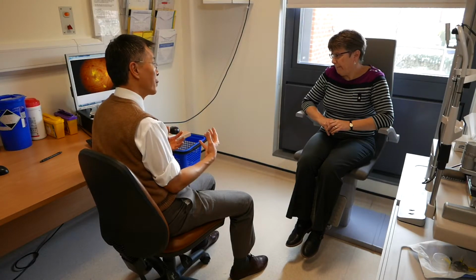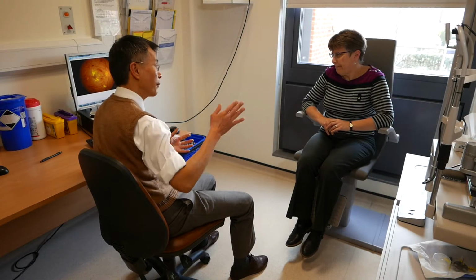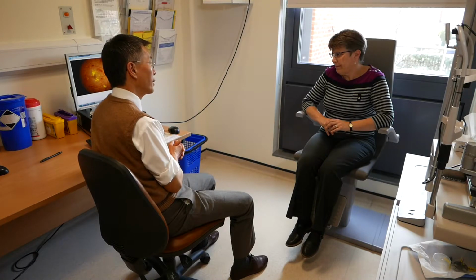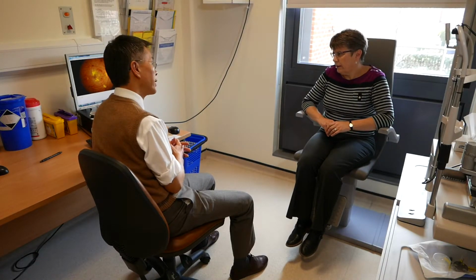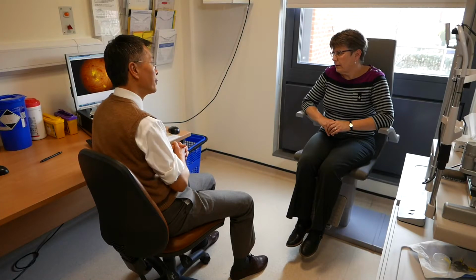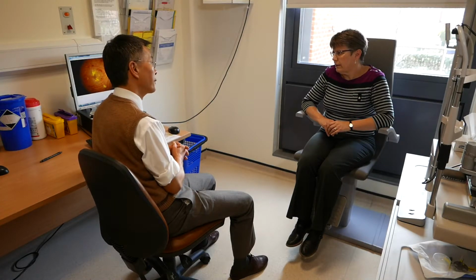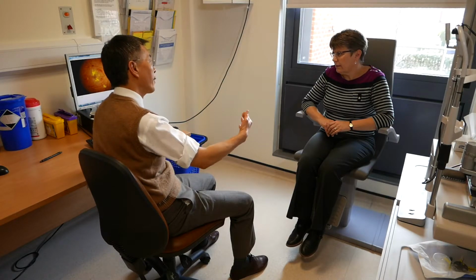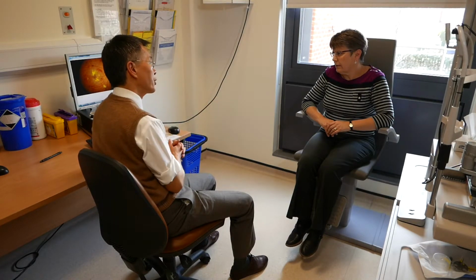Laser is a bright beam of light. You sit in front of a machine very similar to what you've just gone through. It takes a little bit longer, perhaps 10 minutes, for the laser treatment to be applied. Generally not painful, and it's a day procedure. So you come along like you've done today, have it done, and then you're free to go home. There's no particular aftercare afterwards. And the likelihood is that thereafter you may need a few more sessions of laser. Right, okay.